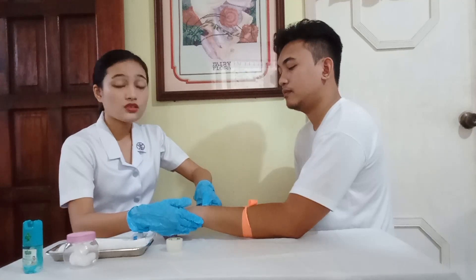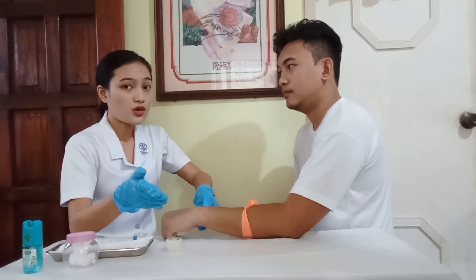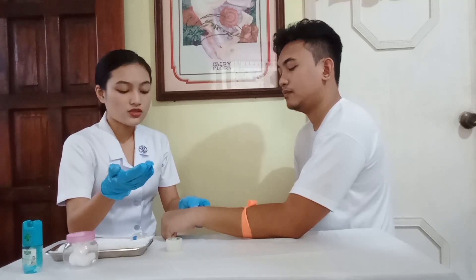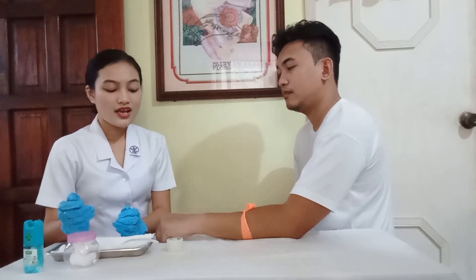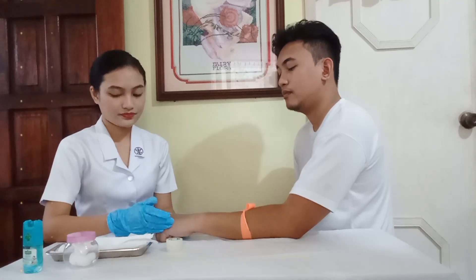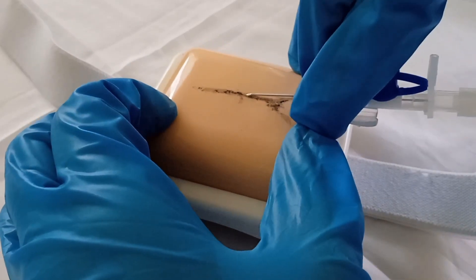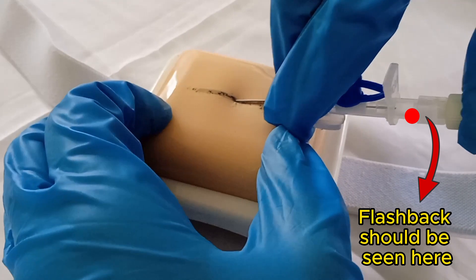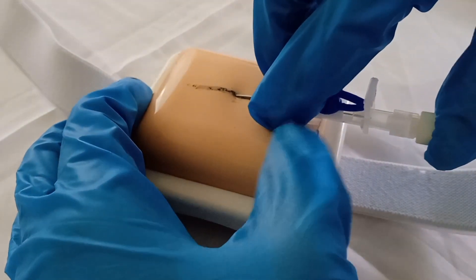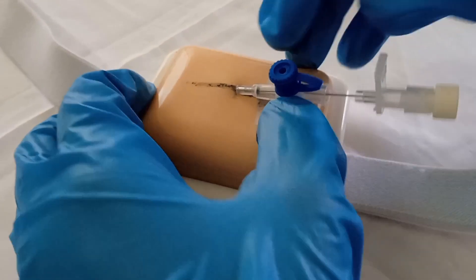This is done because the tourniquet should be tight enough to obstruct the venous flow but should not be so tight that it would also obstruct the arterial flow. If arterial flow is obstructed, then venous filling is also inhibited. So, I could feel the patient's radial pulse. I am going to use my right-sized cannula and I am going to prick the patient's skin, as using the right-sized cannula would help us prevent complications. Piercing the skin with the needle positioned at a 15 to 30 degree angle, upon flashback visualization, decrease the angle and advance the catheter and stylet one-fourth inch into the vein. Position the IV catheter parallel to the skin, hold the stylet stationary and slowly advance the catheter until the hub is 1 mm to the puncture site.